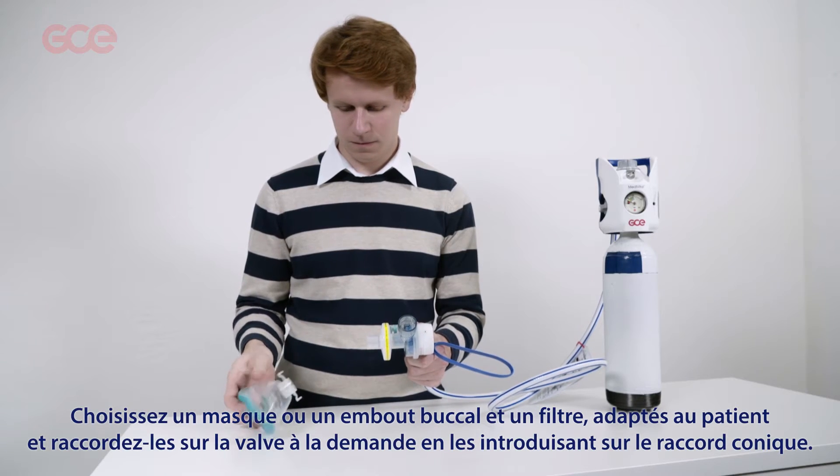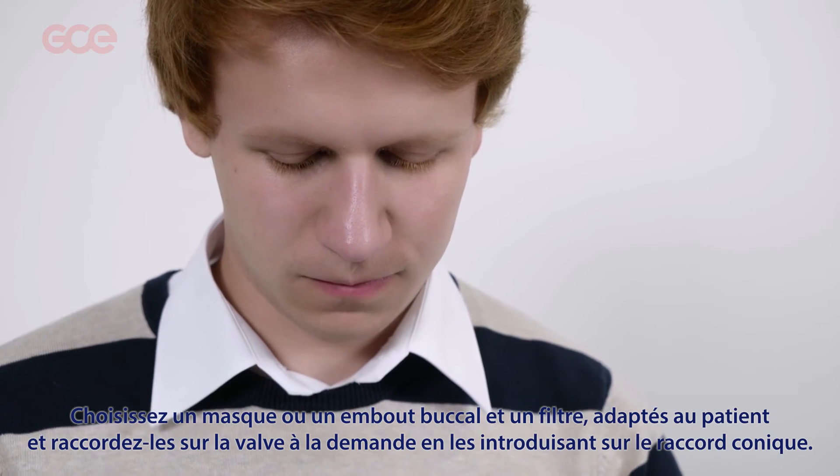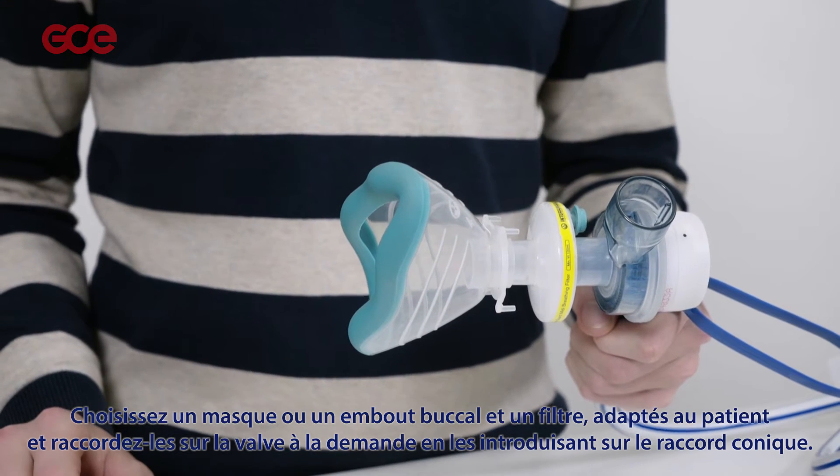Select a mask or mouthpiece and an antibacterial filter as appropriate for the patient, and fit to the demand valve by pushing it over the tapered outlet.